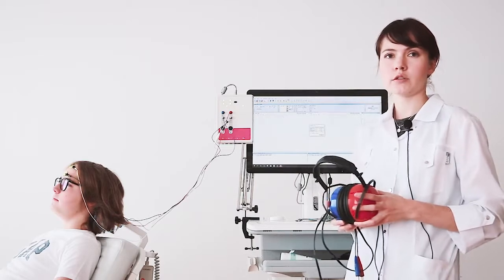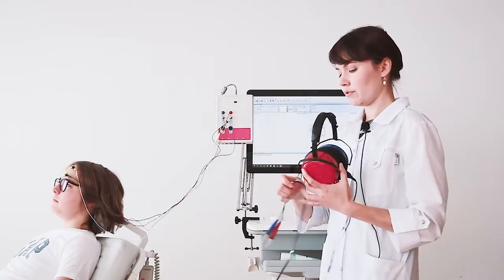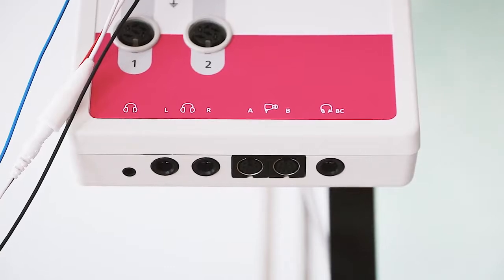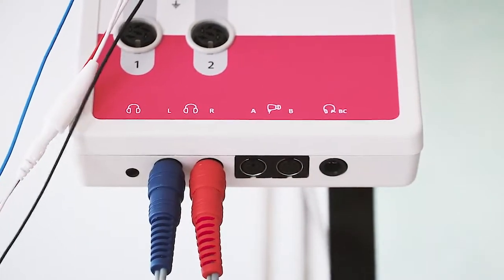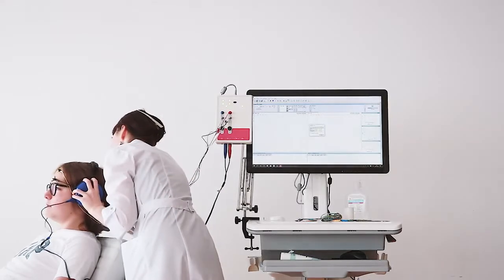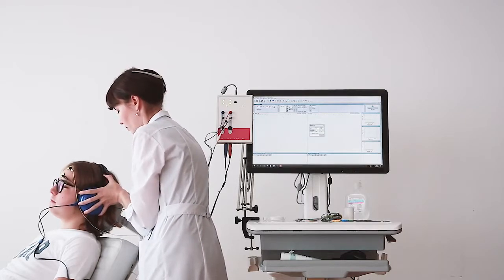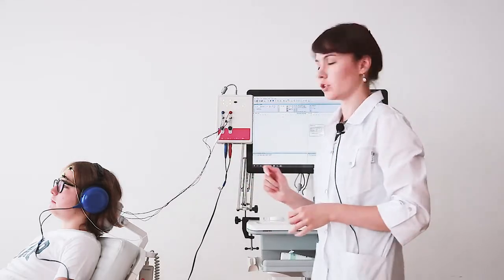Also, you can use insert earphones as the stimulator. To connect the stimulator to our amplifier, we use a connecting cable. Note that the left is blue and the red is right. Also here, the red is for the right ear and the blue is for the left ear. Now we can put it on the head. You can regulate the size to the size of the head of your patient.